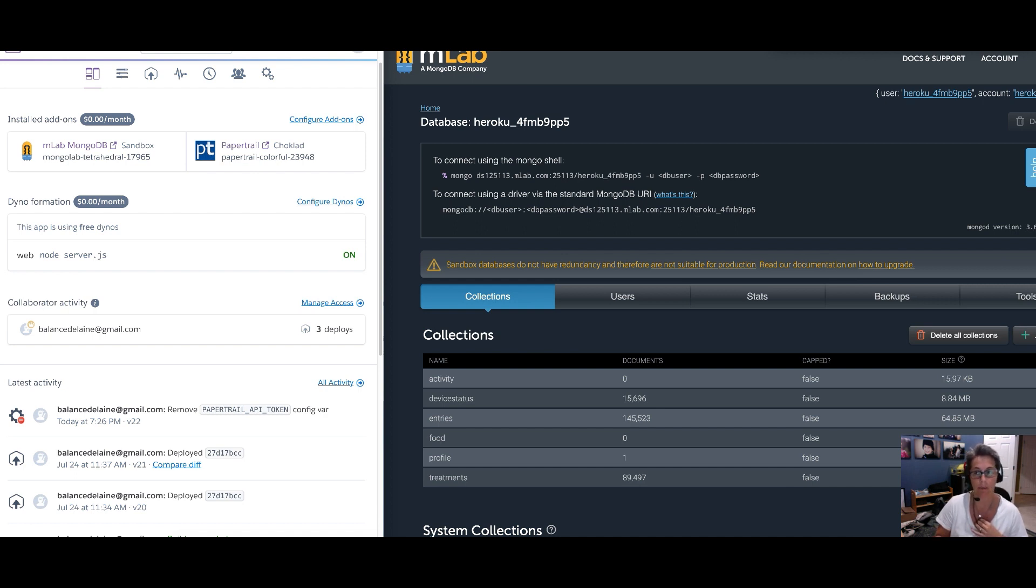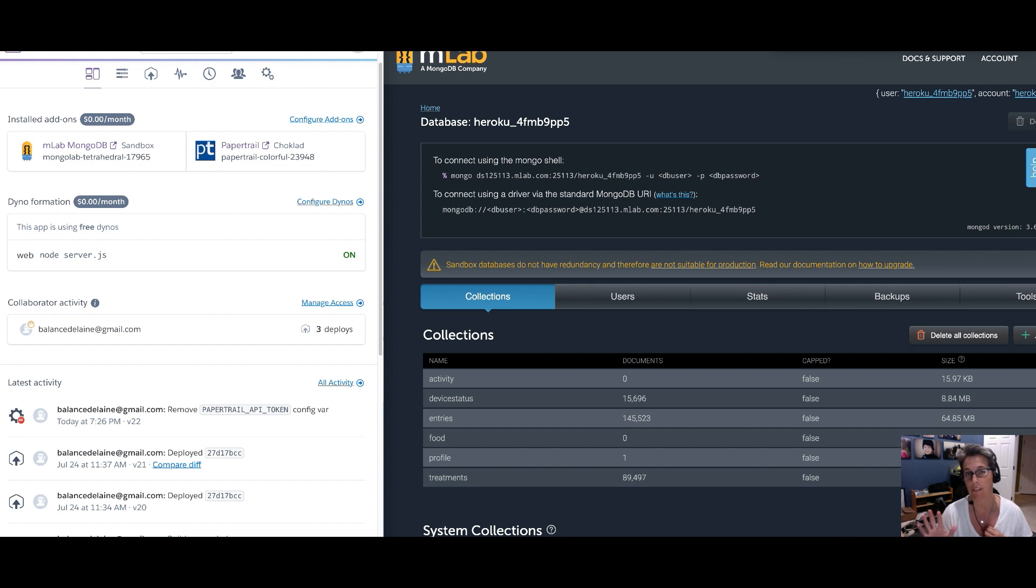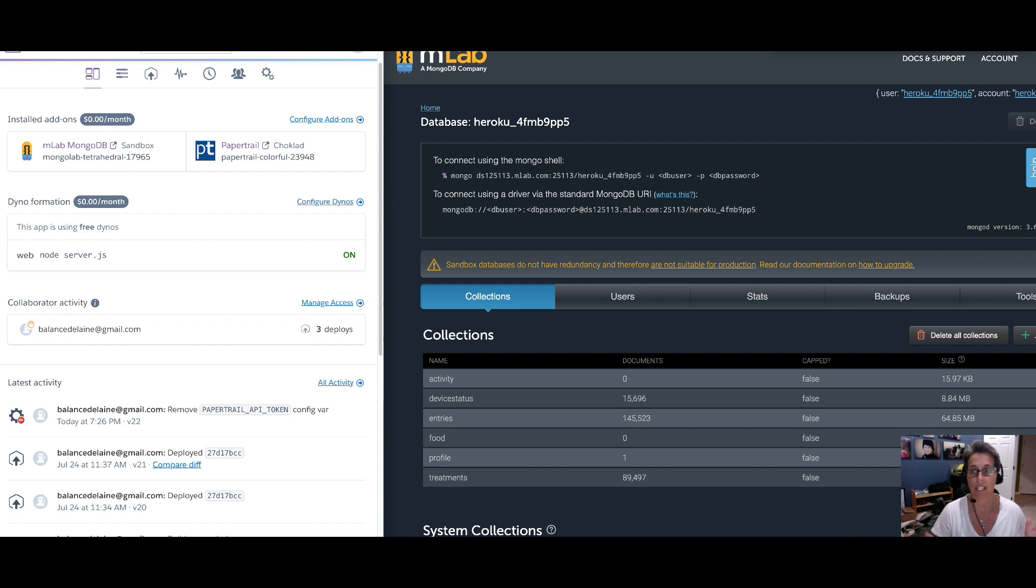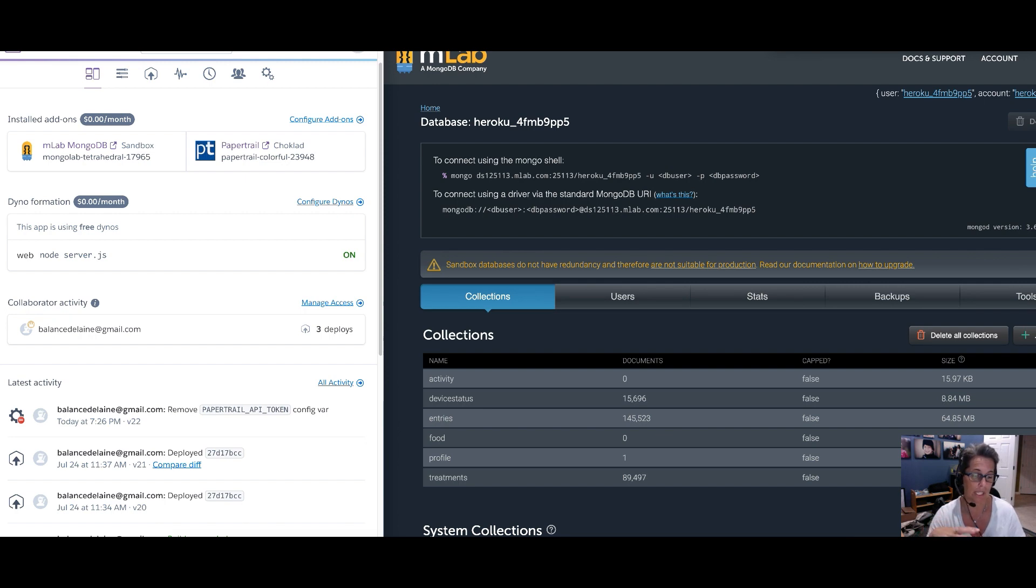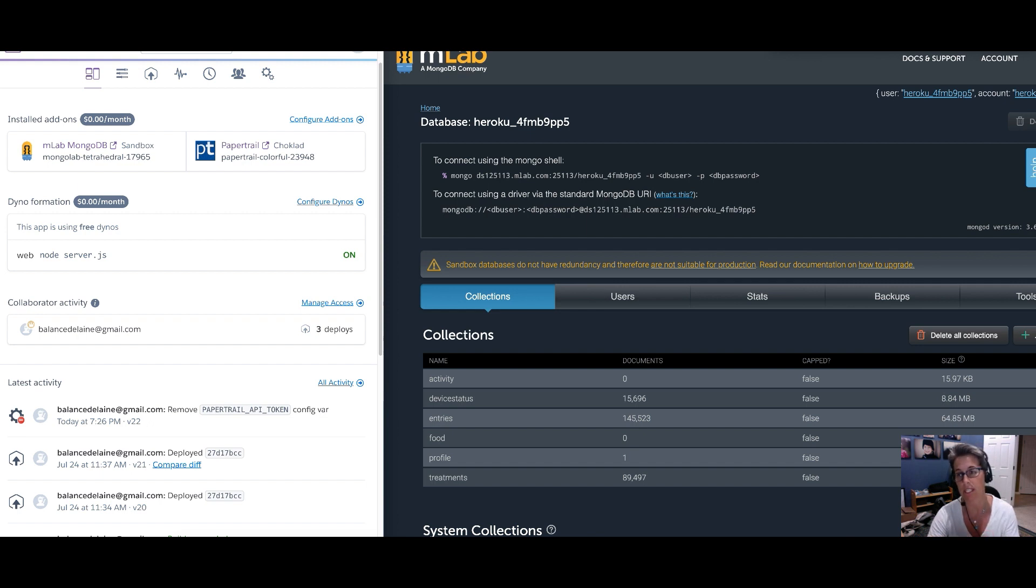When you set up your Nightscout site, it comes with a free database of 500 megabytes. So all of your loop data, all of your Nightscout data, it all goes up into that database and eventually will fill up. It doesn't just fill up with data in one big chunk, it also has to do with how efficiently the data is packed together within that database.